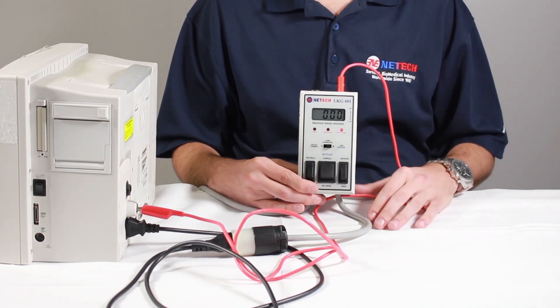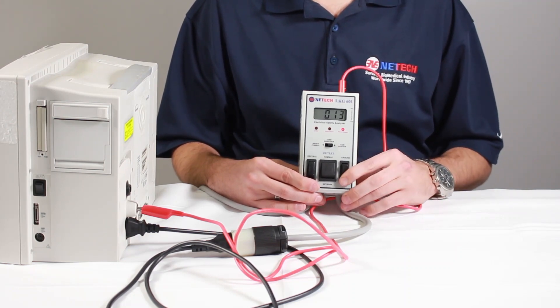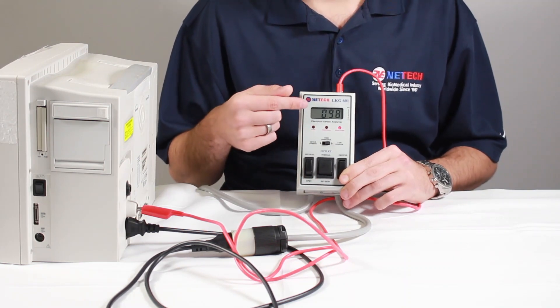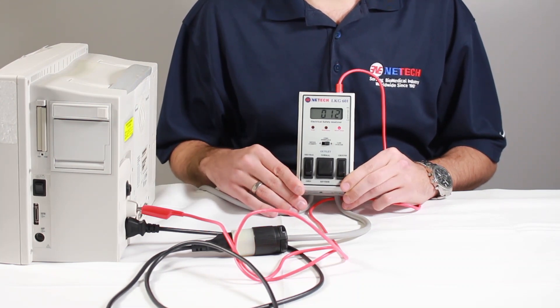To perform our next test, move the three-position slide switch to case leakage. The leakage measurement is made internally when the ground switch is momentarily open. The result will be measured in micro-amps and displayed on the LCD screen as shown.